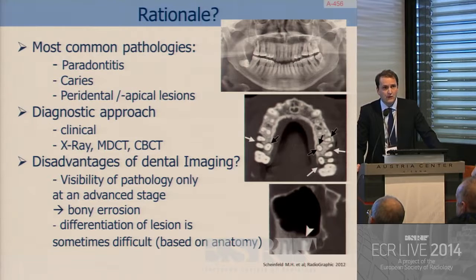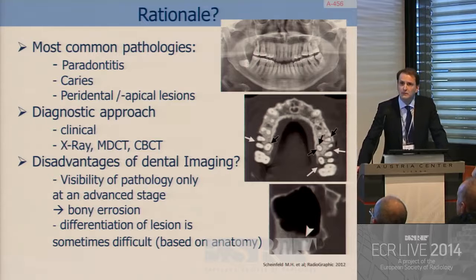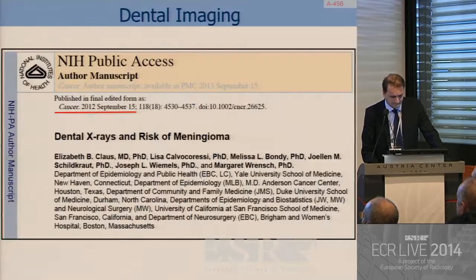The second question is perhaps that we see cystic or tumorous lesions that we cannot identify exactly with CT. We are based mainly on anatomic descriptions of these lesions. We try to get to the right answer, but there might be some help from MRI as well.